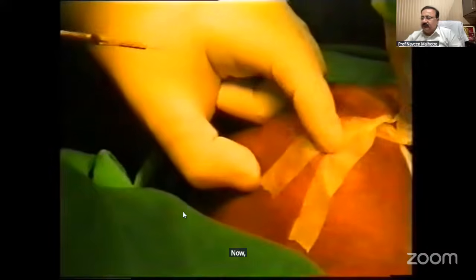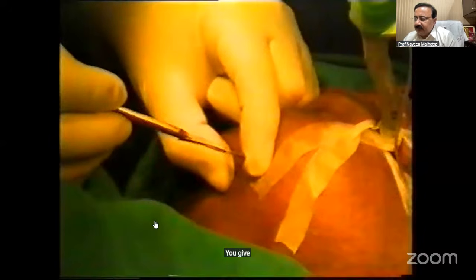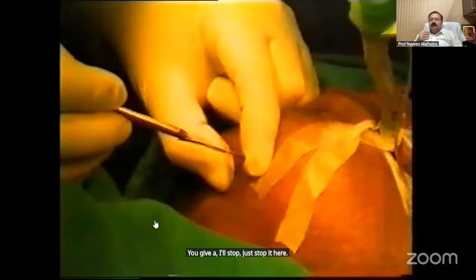Now, this is the important thing. Just stop it here. Make a 1.5 centimeter incision parallel to the inferior border of the mandible. And this incision is 1.5 centimeter lateral to the mentum.